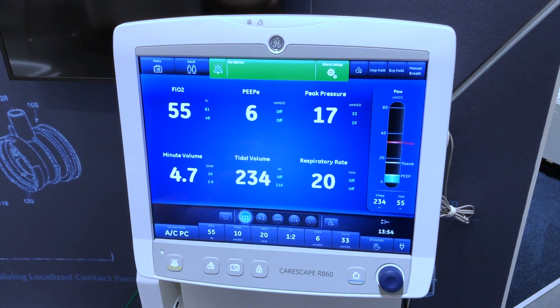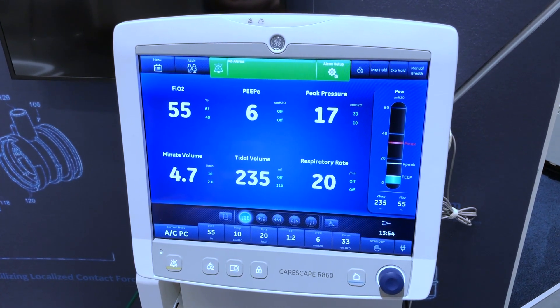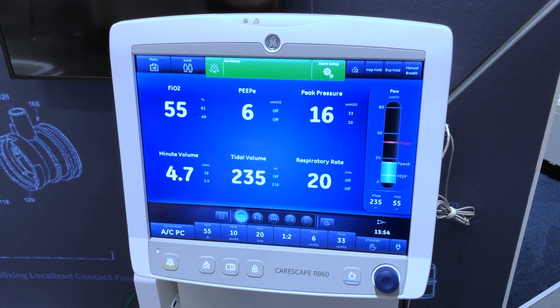In this video you will learn how to pause ventilation and turn off the Carescape R860. Disconnect the patient from the breathing circuit.